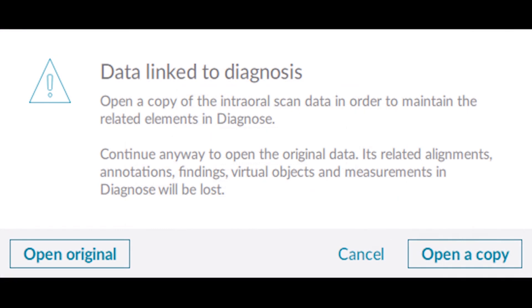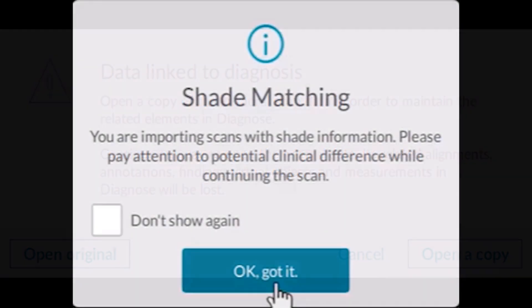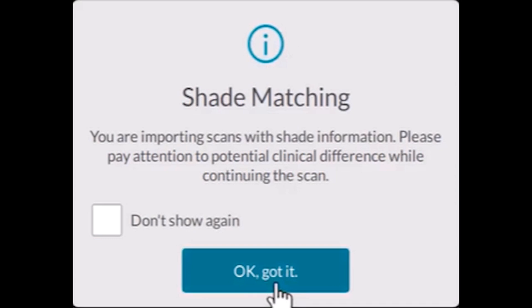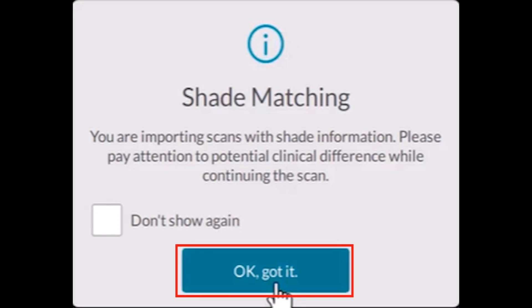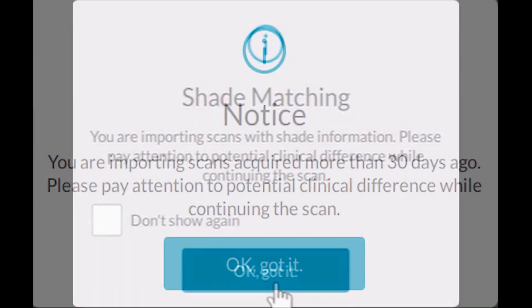If the window Data Link to Diagnosis pops up, select the Open a Copy option to avoid losing previously saved diagnosis data. If the window Shade Matching pops up, after reading the message, you can check the box Don't Show Again if desired, or select OK, got it.